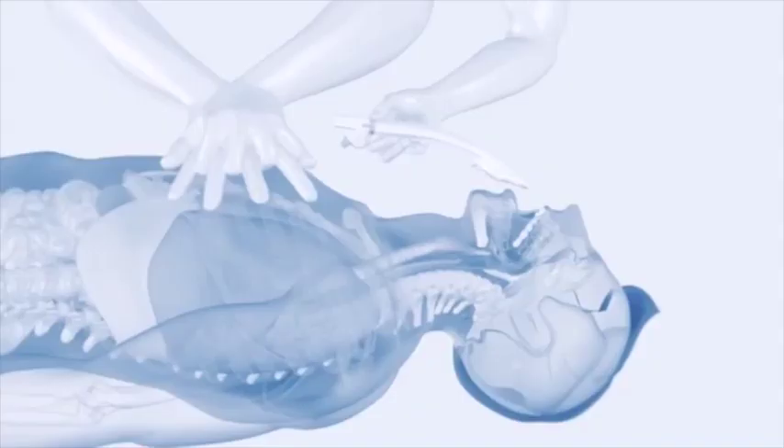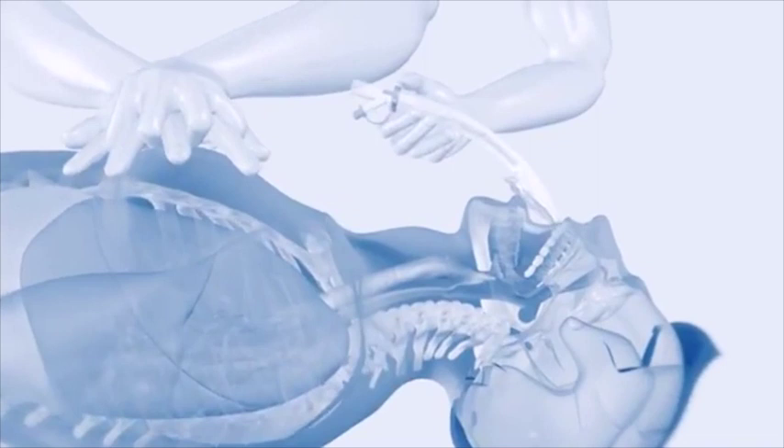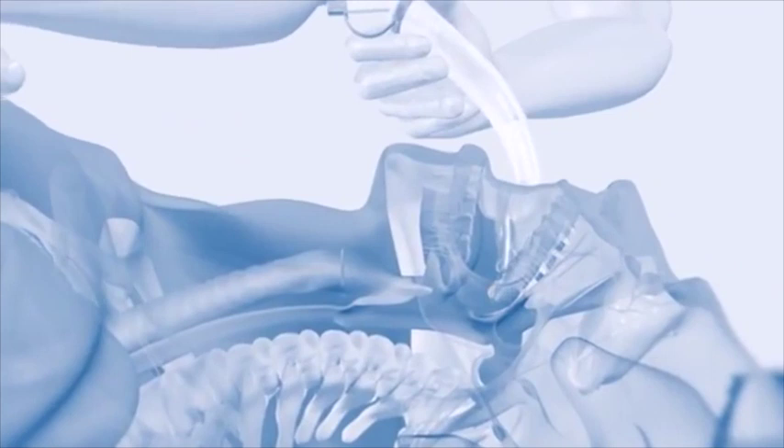In this video, CPR is in progress, and as you can see, compressions do not need to be interrupted while the IGEL is being placed. Please remember that endotracheal intubation via the King Vision is still the preferred method of securing the airway in all patients.